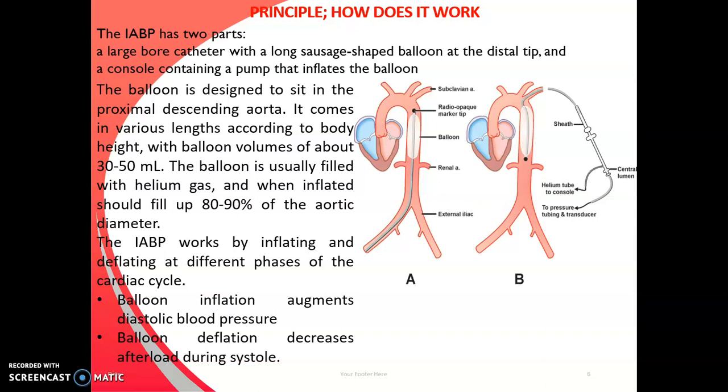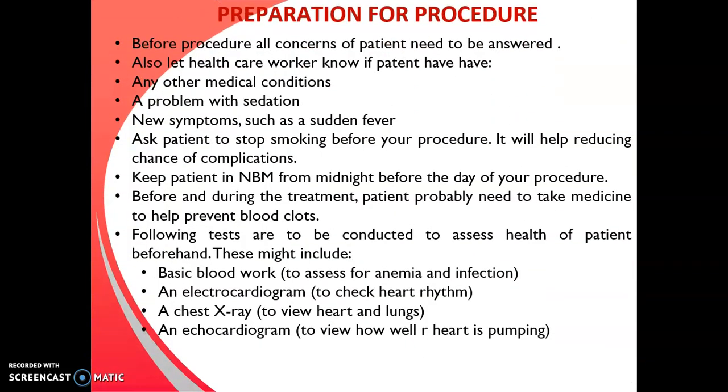Balloon inflation augments diastolic blood pressure. Balloon deflation decreases afterload during systole. Before the procedure, all concerns of the patient need to be answered. Also, let the healthcare worker know if the patient has any other medical conditions. It is also very important to find out if the patient has a problem with sedation.